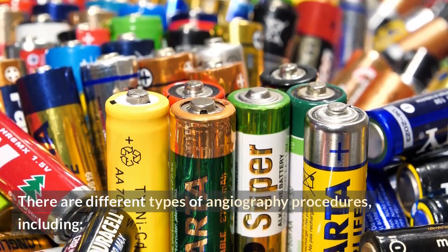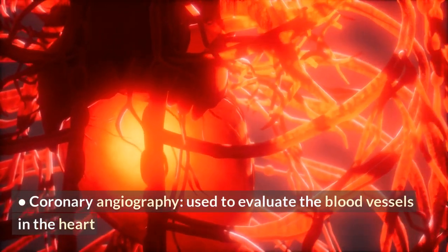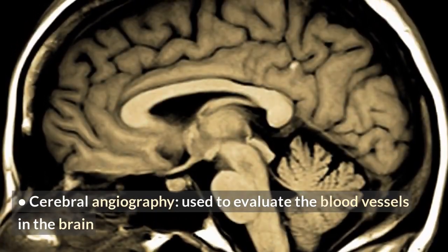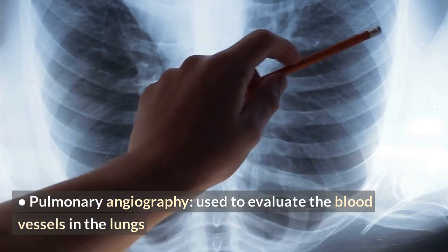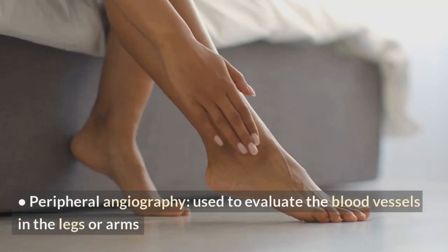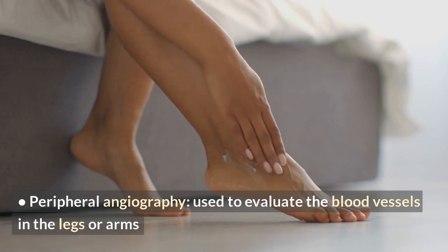There are different types of angiography procedures, including coronary angiography, used to evaluate the blood vessels in the heart; cerebral angiography, used to evaluate the blood vessels in the brain; pulmonary angiography, used to evaluate the blood vessels in the lungs; renal angiography, used to evaluate the blood vessels in the kidneys; peripheral angiography, used to evaluate the blood vessels in the legs or arms.